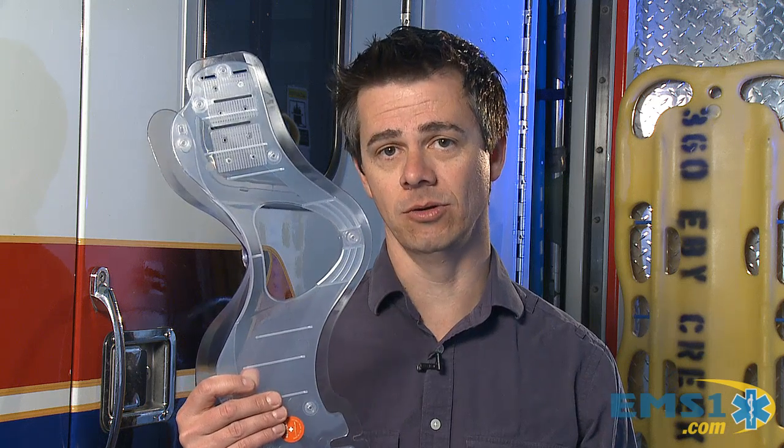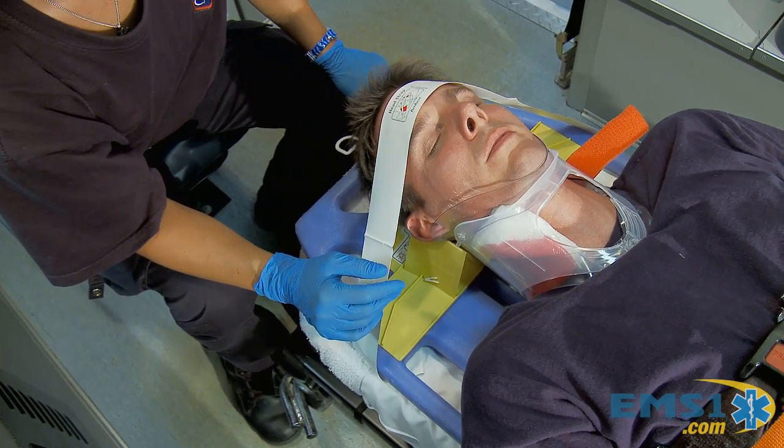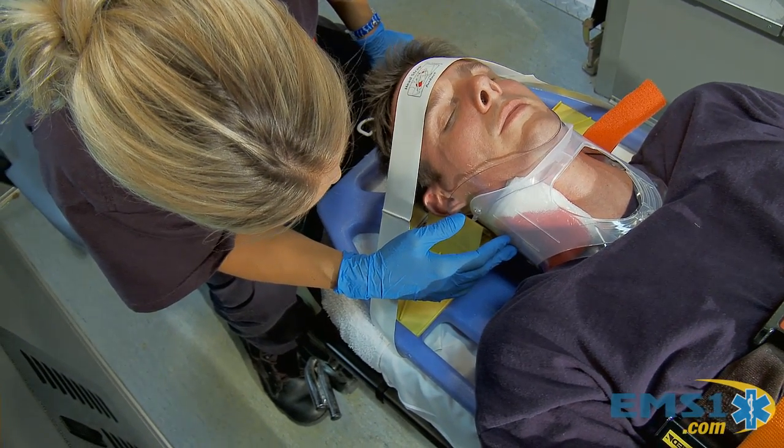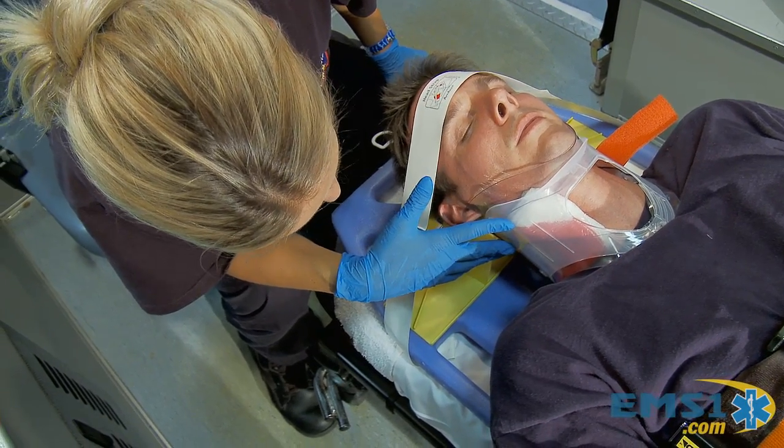And then finally, once they get to the ER, the doc wants to rip this off. But now you have a clear choice. You have something you can see right through. You can check for JVD. You can check the wound without removing the collar, without presenting additional problems for the patient. It's rigid, it's nice, it has a good feel to it, and it's going to do a much nicer job reminding the patient not to move their neck. Once you get to the ER, the doc can go, 'yep, that's exactly what's going on,' and move them right to the CAT scan or X-ray department without needing to take this off and reassess the patient afterwards. This is the Clear Collar, and I'm Chris Montero for the Innovation Zone.